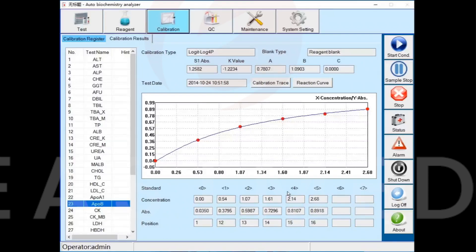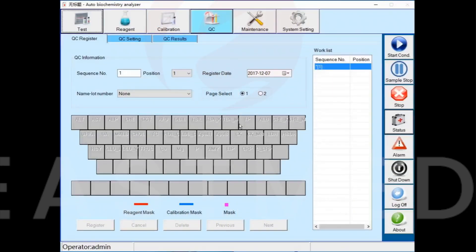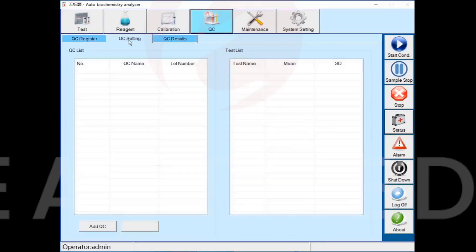Eighth part: Quality Control. Every day, before testing samples, the analyzer needs quality control. For the first QC analysis, you need to enter the QC setting interface to set the QC parameters, add QC name and batch number.